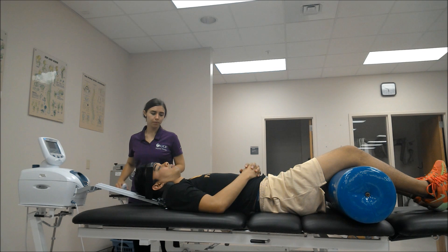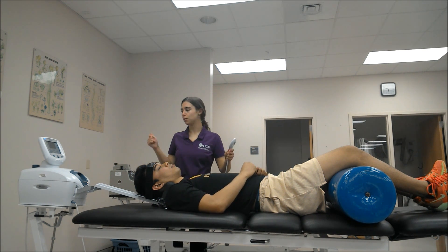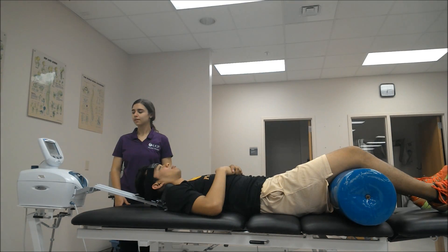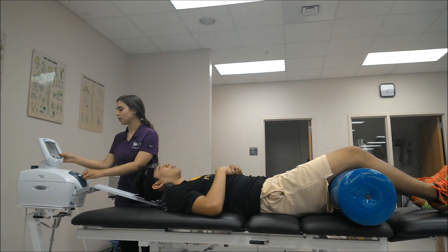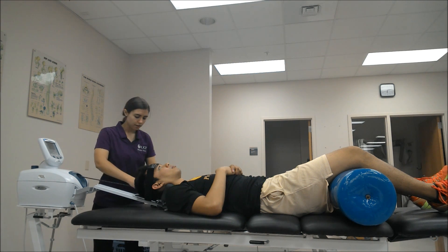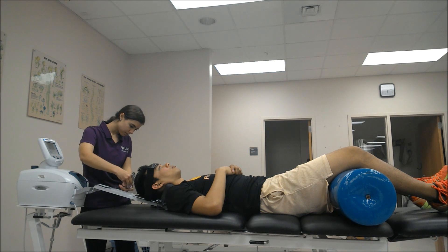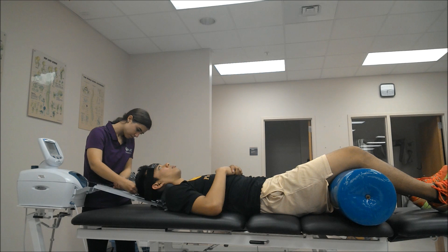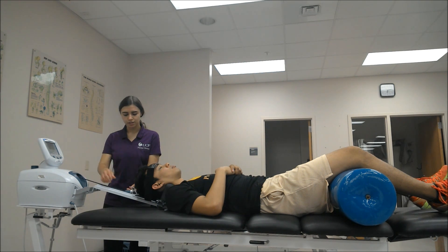Then give your patient the safety cutoff switch so that he's able to stop the machine immediately if he feels an increase in pain. Now attach the rope to the halter by holding down on the rope release button and pulling. Then attach the metal piece to the top of the halter, and press the rope release button again in order to take up any slack.